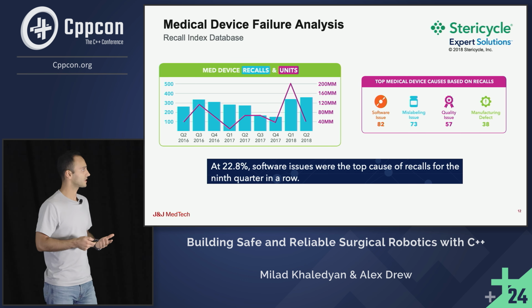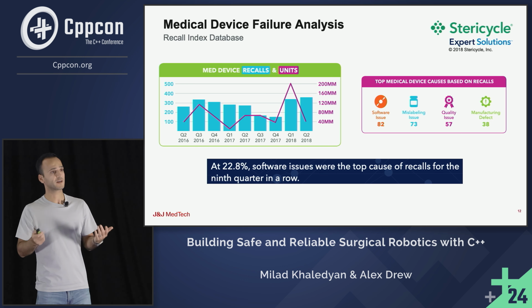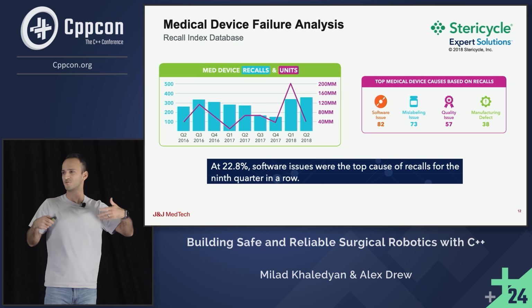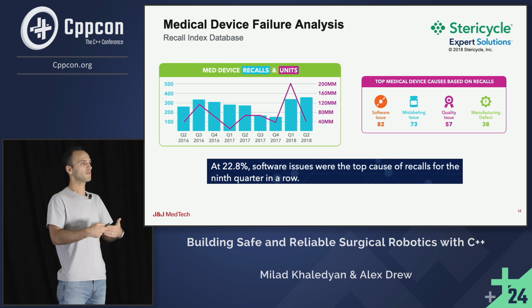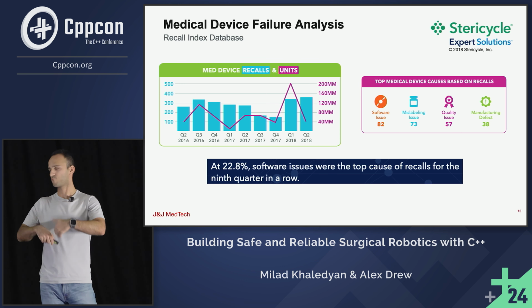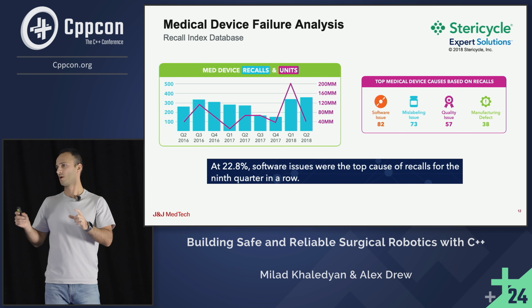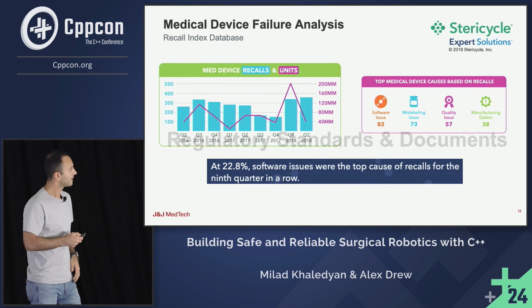So that's tons. And given the ever-increasing complexity of software in the medical device market, there is a lot of demand for more complex software. And when you have more complex software, you're going to have a lot more issues because it's very hard to manage. And then we have a new threat, cybersecurity. Given cybersecurity and software being super complex, software is and will be at the core of many issues, maybe even the top cause. When we talk about software, we don't necessarily mean the UI part of things. We talk about the software design, the implementation, the usage of languages and things like that.